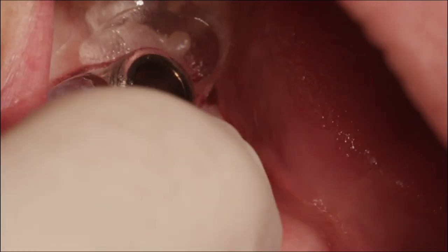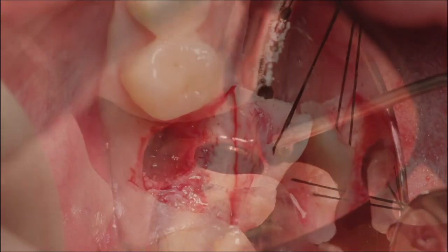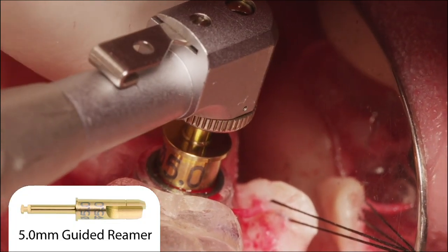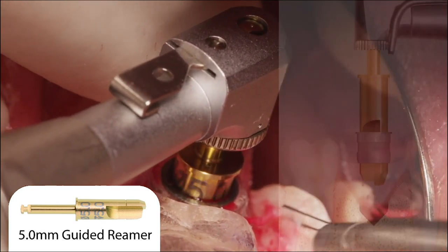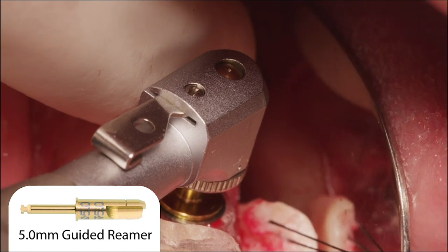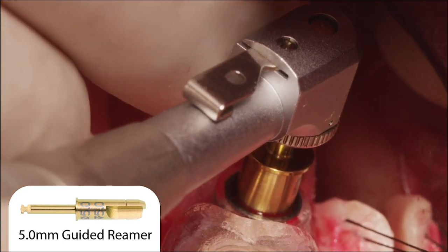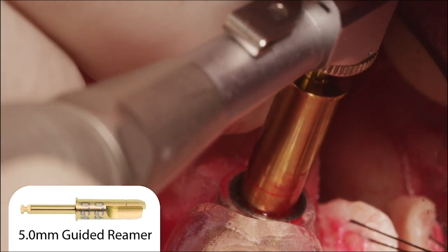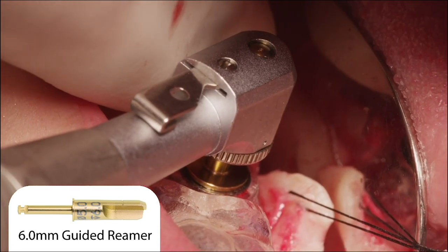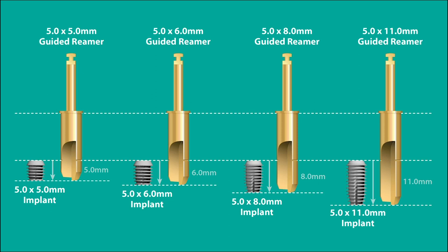Insert the guide into the mouth and start with the spade drill, rotating at 400 RPM with external irrigation. Next, deepen the osteotomy with sequentially longer guided reamers, rotating at up to 50 RPM without irrigation. As with the spade drill, only begin rotating the instrument once the tip of the instrument has contacted bone. The full depth is reached when the guide stop contacts the guide ring. The final reamer should correspond with the length of the intended implant.